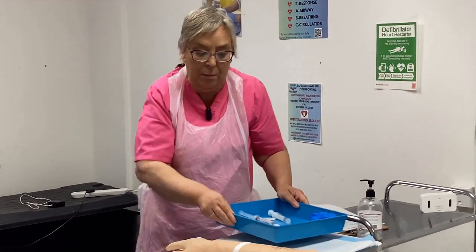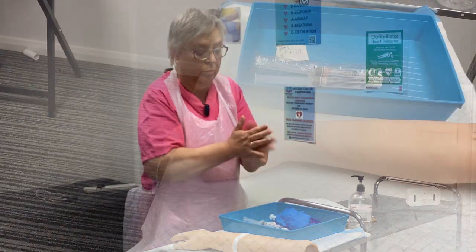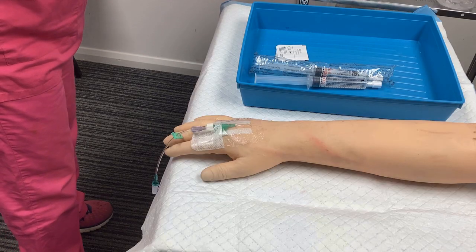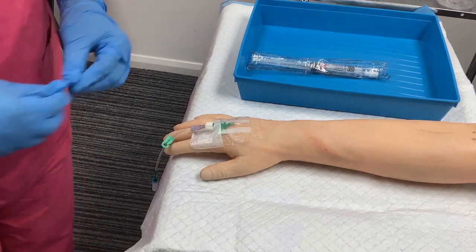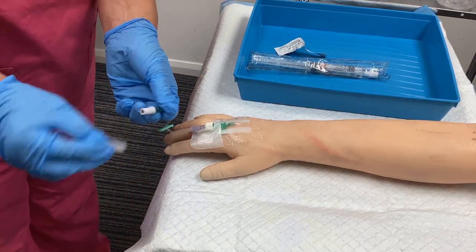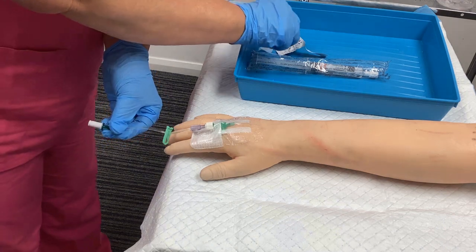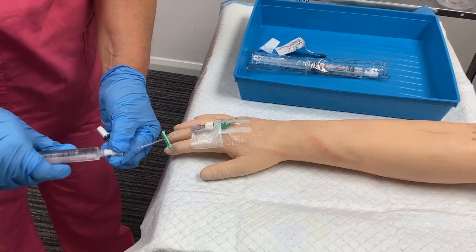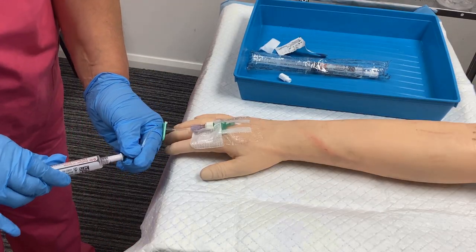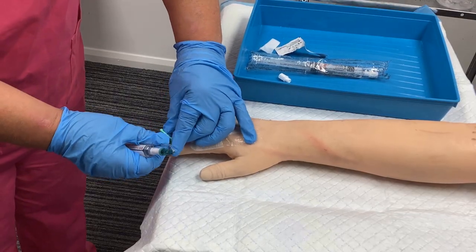So I'm going to take this to Mrs. Jones and Emma, I've got your medication here to give you. I'm just getting my hands clean again. And I'm just going to put my gloves on. So I'm going to take my mediswab and clean the end of this connector for 30 seconds with the alcohol swab. And then I'm going to let it dry for 30 seconds. Then I'm going to take my IV flush, disconnect the tap there. And then in an aseptic non-touch technique, I'm going to connect the end of this syringe, which means I'm not going to touch the end of that bung. And then I'm going to undo the clip once I've connected it.